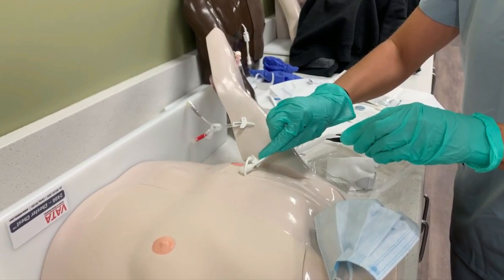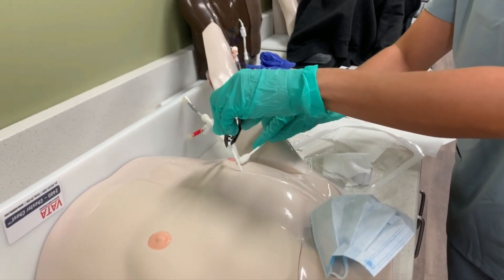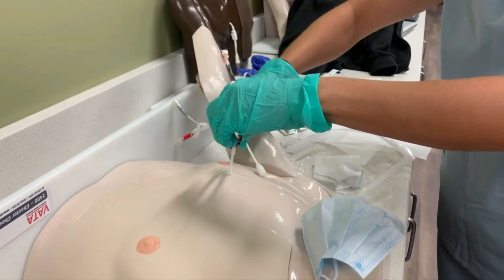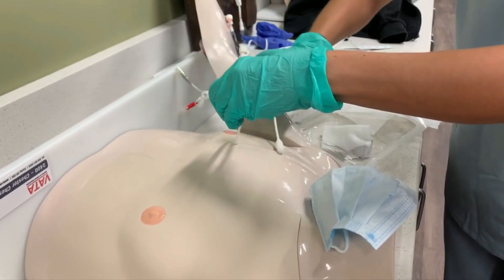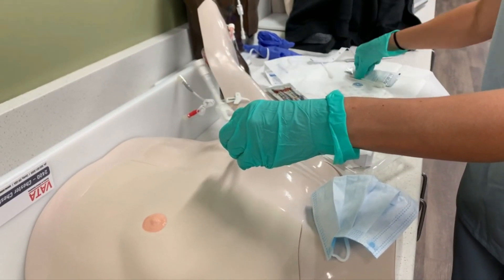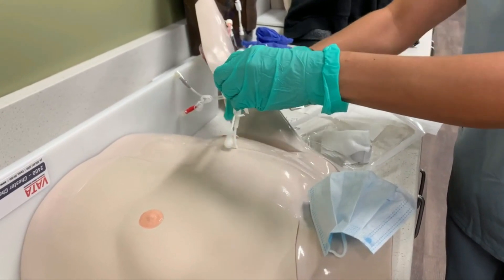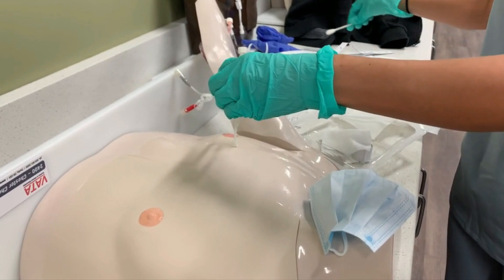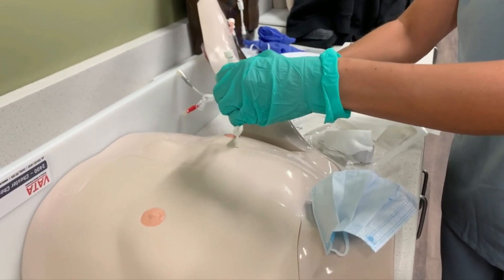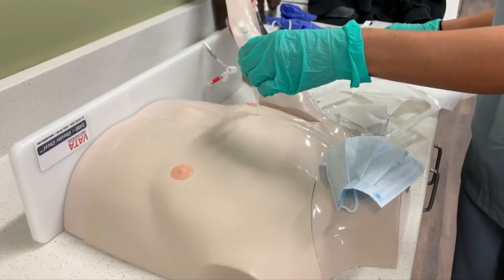Start in the center and work your way out. You don't backtrack — just go in a circle from the inside out. This dressing is pretty big, so go as far out as your dressing is going to be, then throw that swab away and do the same thing again. You're going to do that three times in the same way. I also like to clean all the way up to the top of the line as well. Then let that dry.